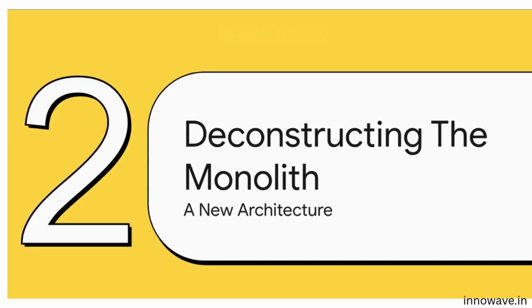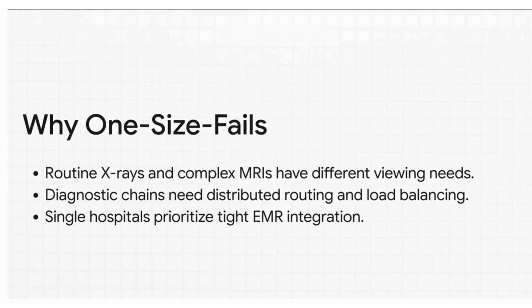It's time to deconstruct. Let's look at why this one-size-fits-all approach just doesn't cut it in the real world. A radiologist who's just reading simple x-rays all day needs a super fast, lightweight viewer. But a neuroradiologist analyzing a complex brain MRI needs powerful, advanced 3D visualization tools. A big chain of clinics needs to balance workloads across different cities, while a single hospital might just care about tight integration with its own EMR. A monolith forces every single one of them into the same clunky, ill-fitting system.